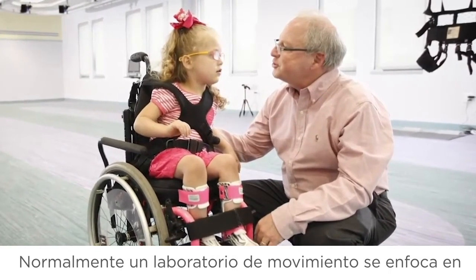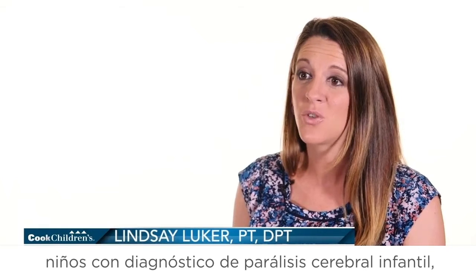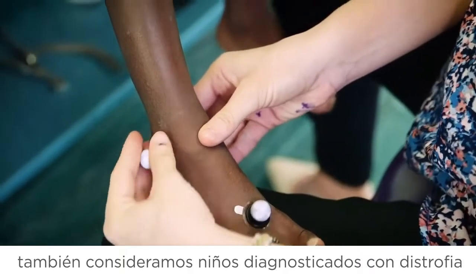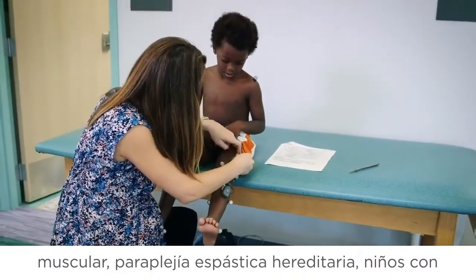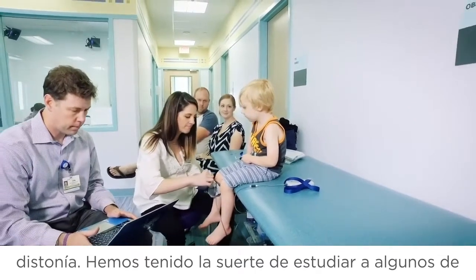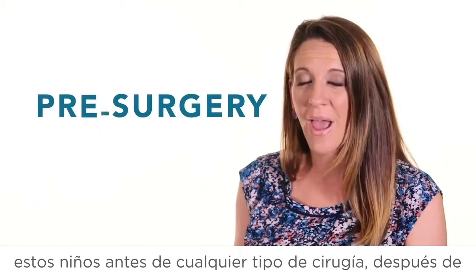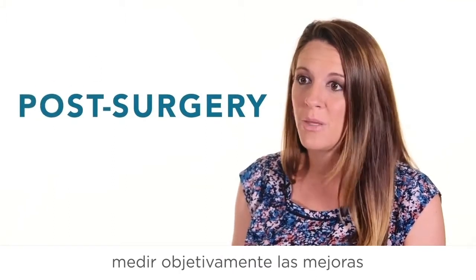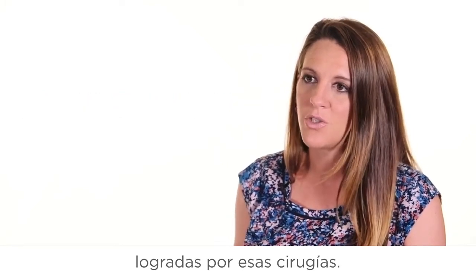Typically a motion lab is focused on children with a diagnosis of cerebral palsy. We are also considering children with a diagnosis of muscular dystrophy, hereditary spastic paraplegia, and children with dystonia. We've been fortunate enough to study some of these children prior to any kind of surgical intervention, have them undergo the surgery, and then have them return to us so that we can objectively measure the improvements made by those certain interventions.